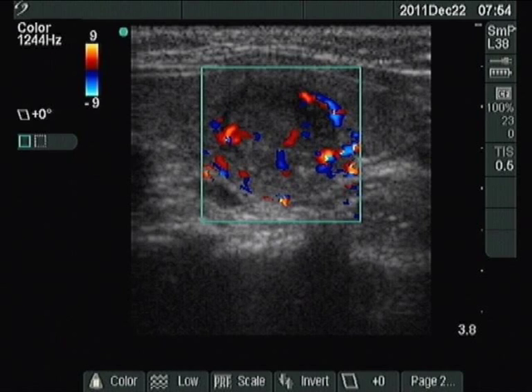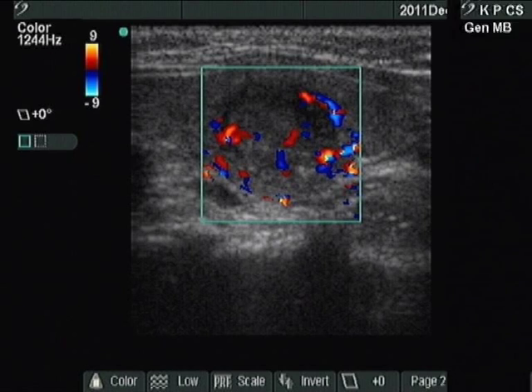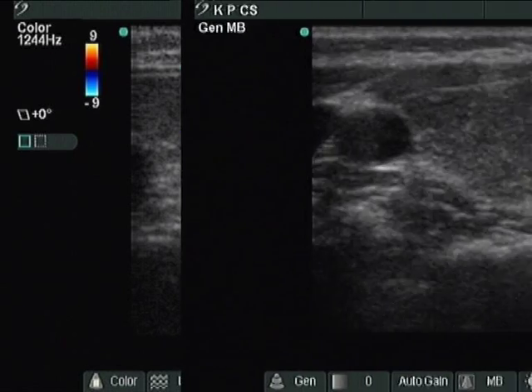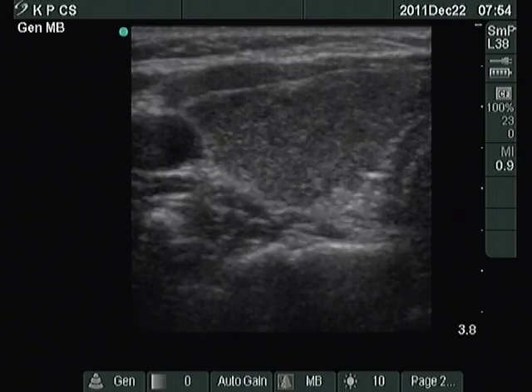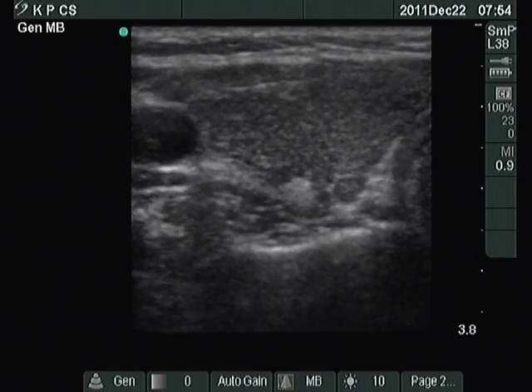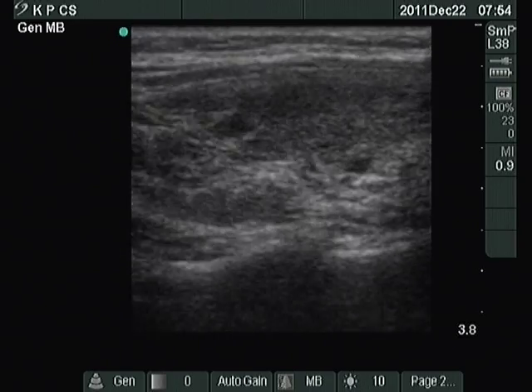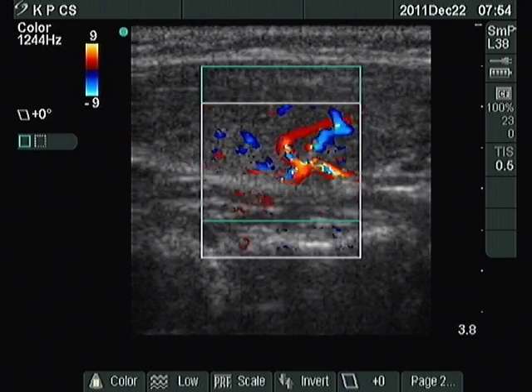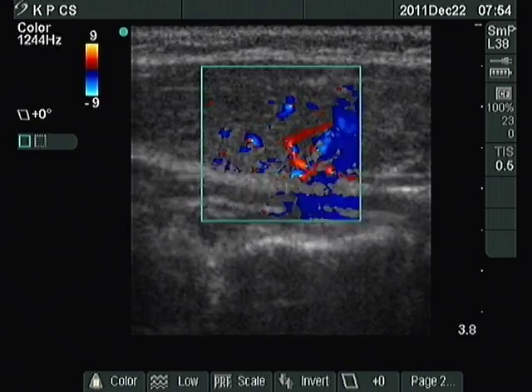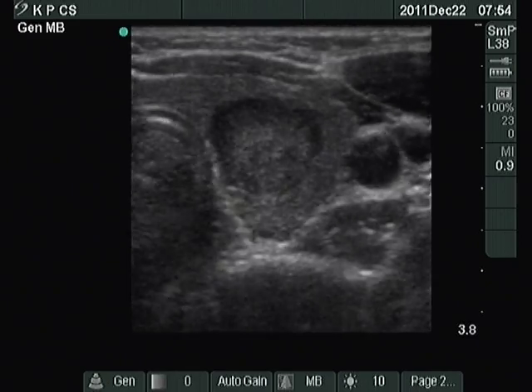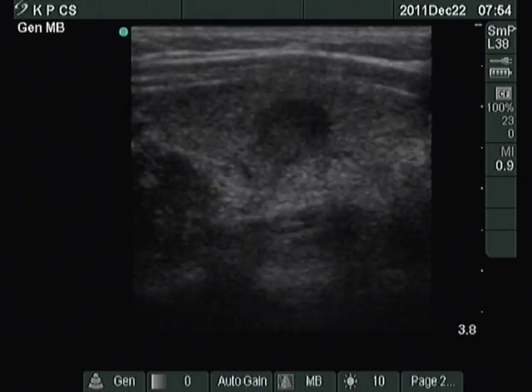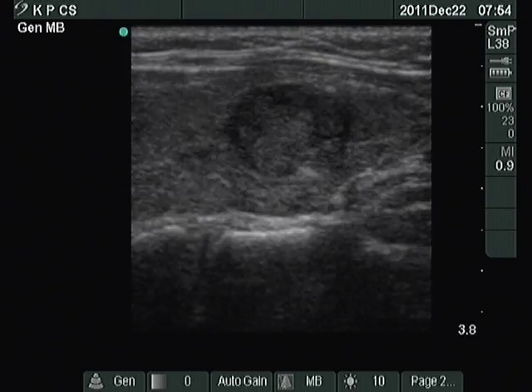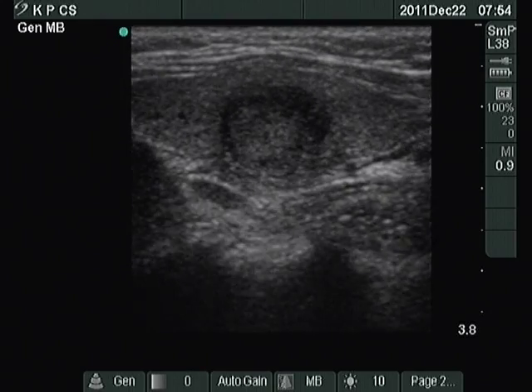This is a combined type 2 and type 3 vascular pattern. At first, the right lobe is seen with the typical presentation of lymphocytic thyroiditis in the video. Then, the tumor is presented in the central part of the left thyroid.